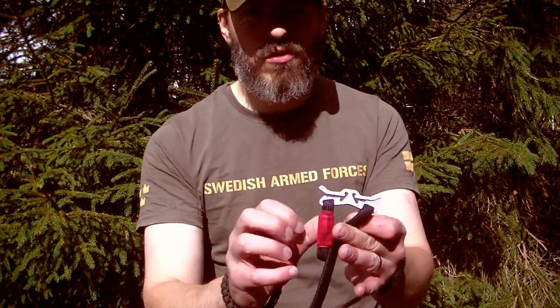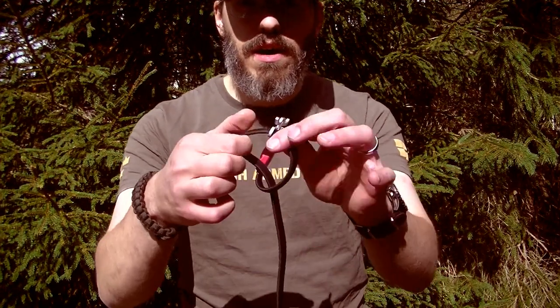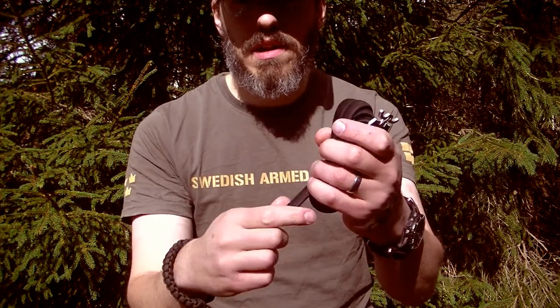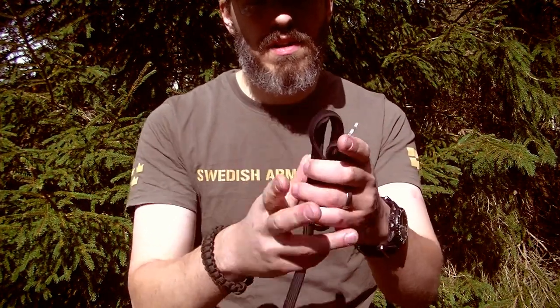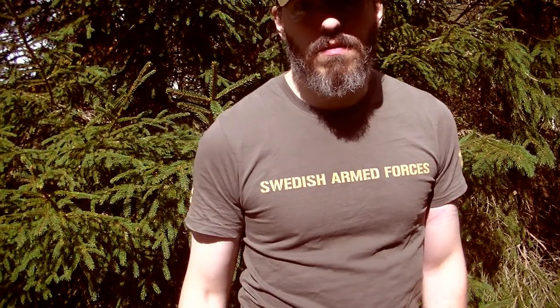This is how I usually store my RATS tourniquet. I always have the three-finger loop there, and then I do it like this — it just unravels very easily. I carry it in my pocket; it fits in any kind of pocket, including normal work trousers.